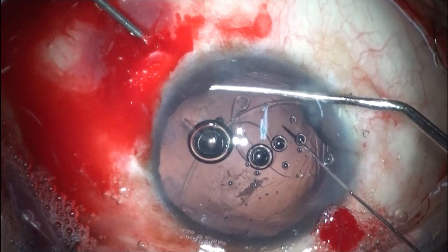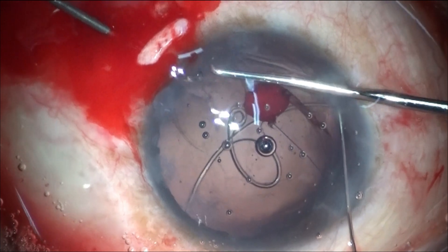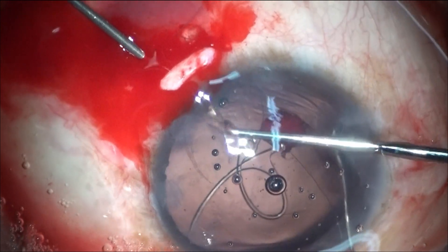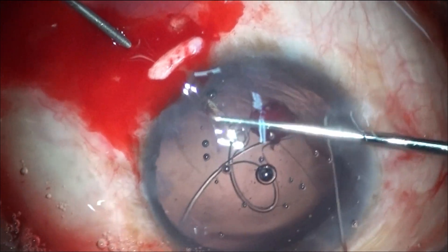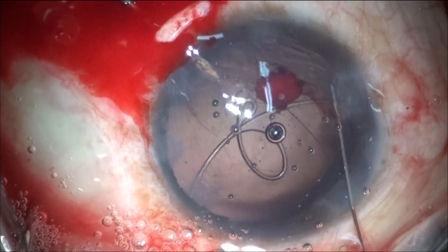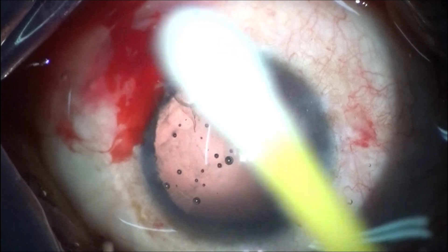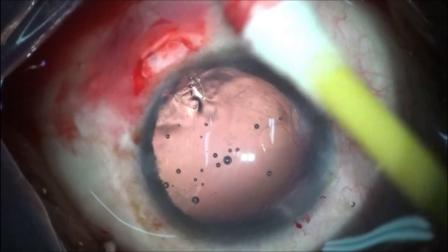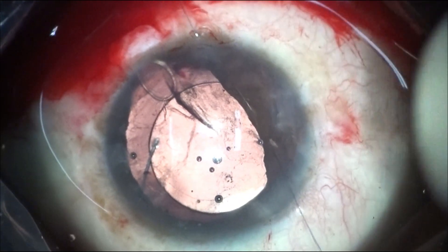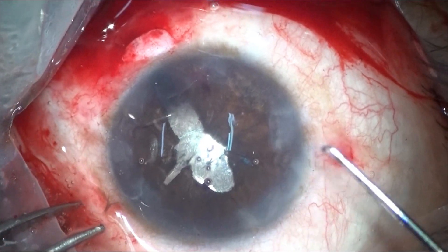I am using the Sinski to check that the needle comes under the iris here, and then I push the needle through it. This is the second pass with the needle, and here as you can see there is bleeding and I cannot clearly see the tip — I don't know whether it has come from anterior to the iris root or posterior. Still I went ahead and fixed the bag using the CT segment, and after implanting the IOL, when I started doing pupilloplasty I realized that in fact the second suture had passed over the iris.